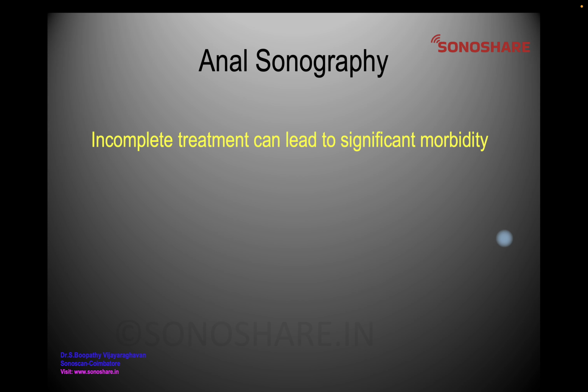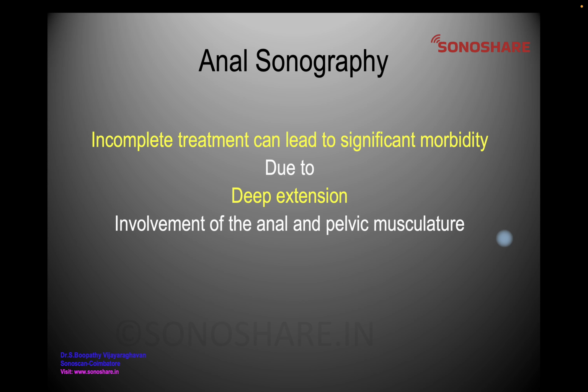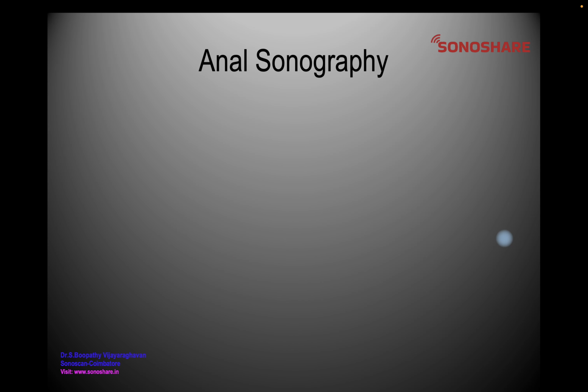Why anal sonography is important? Incomplete treatment of pathology can lead to significant morbidity due to deep extension of the abscess, involvement of the anal and pelvic musculature, perianal spaces, and high rate of recurrence because of lack of knowledge of the pathology and anatomy.